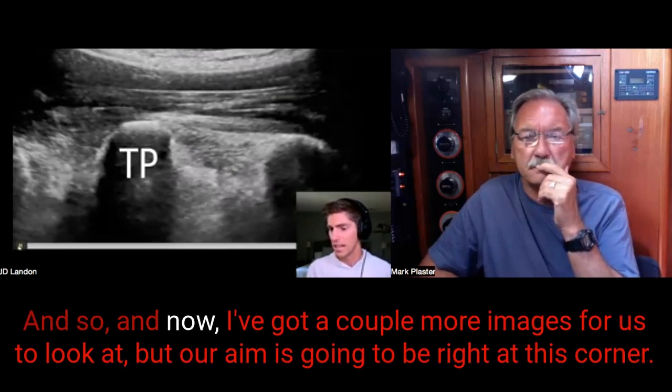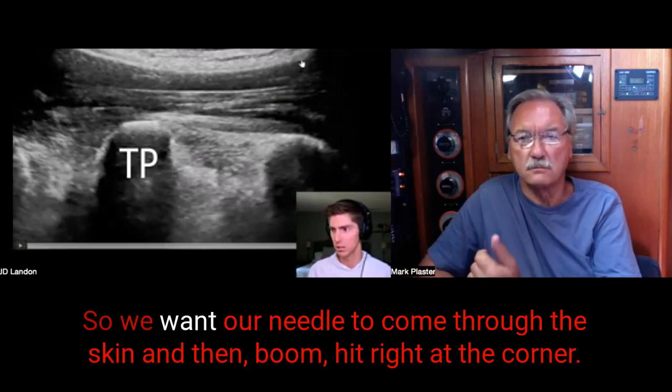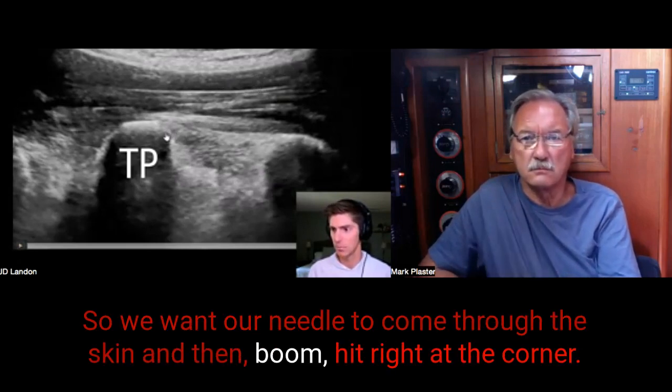Now I've got a couple more images for us to look at, but our aim is right at this corner, where we want to drop our needle. We want our needle to come through the skin and then hit right at the corner.